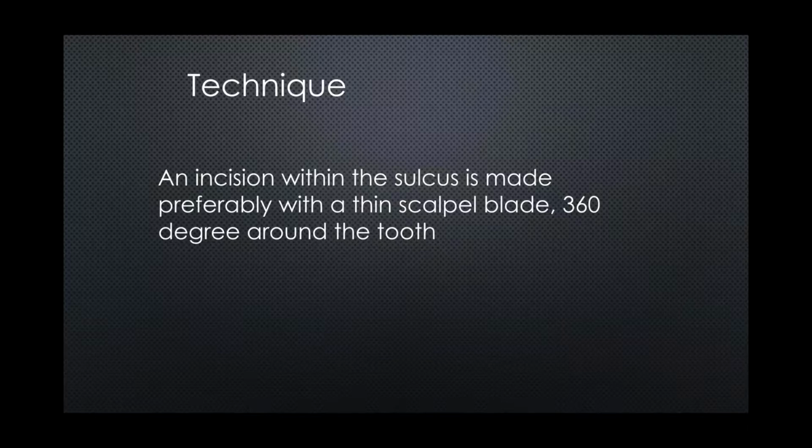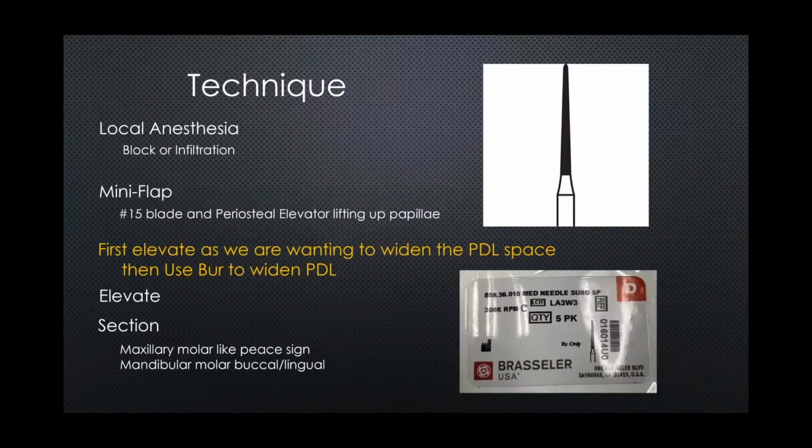And then I take my periosteal elevator, and I'm just going to gently pick up the gingival tissue. So I'll pick up the papilla, I'll pick up my papilla, and just connect them along the buccal tissues. I'll do the same on the lingual. I lift up about 2 or 3 millimeters, and you'll see why in a few minutes when we talk about socket grafting. Same procedure every single patient.